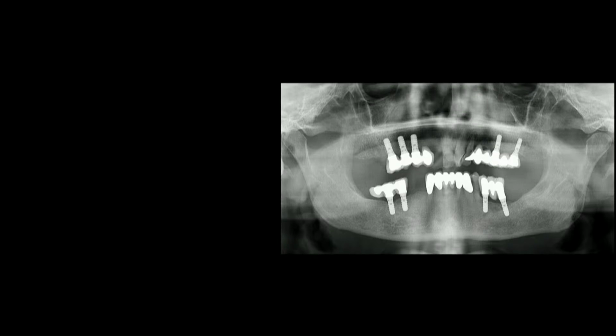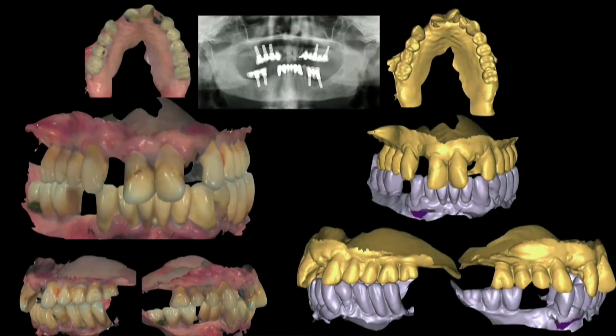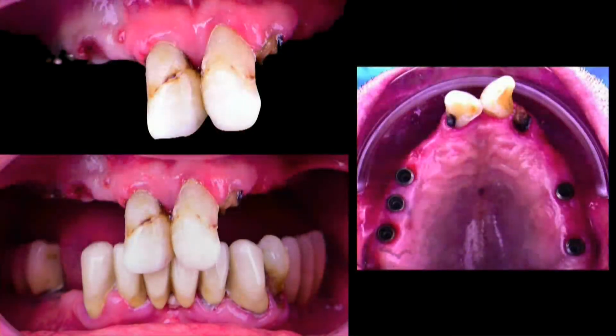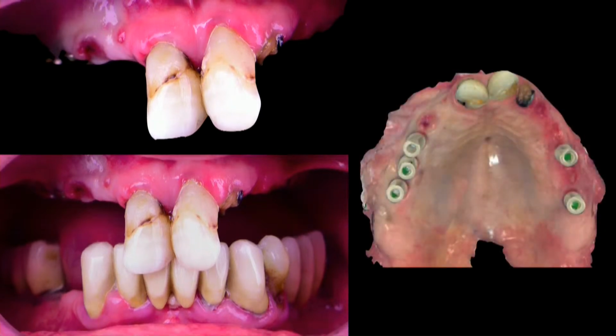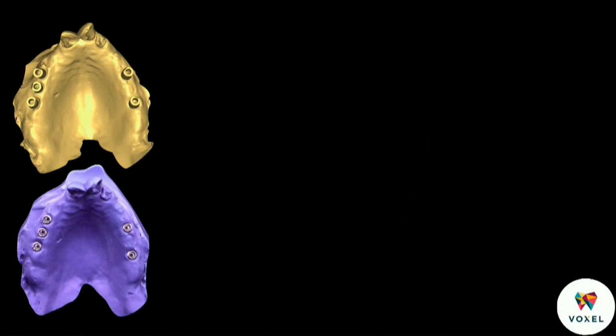Now, obviously, the anterior teeth need to come out because of significant periodontal disease and caries, which is also causing him a significant amount of discomfort. Luckily, the patient presented with good posterior implants that had served him for many years and are still looking very good. So what we decided to do is the scan, convert into colorless scans before doing anything. Go ahead and dismantle the implant crowns in the posterior, attach the scan bodies, convert into colorless scans, and then have a model printed.